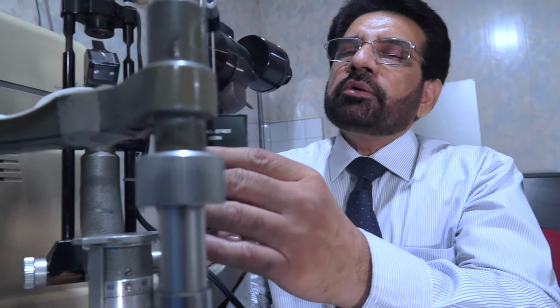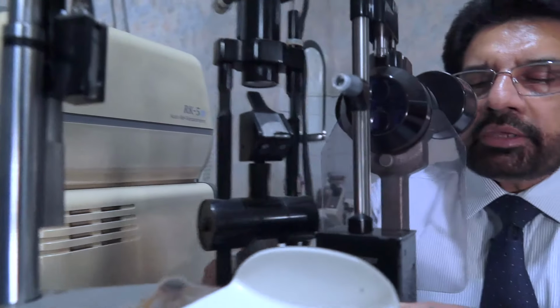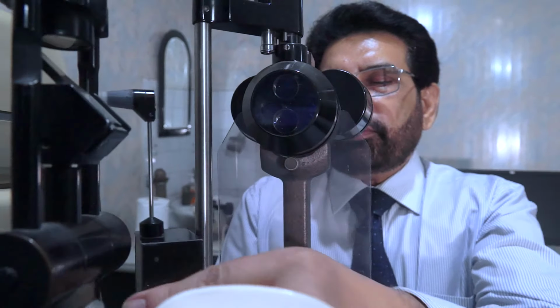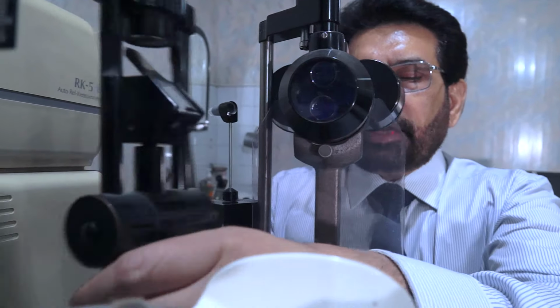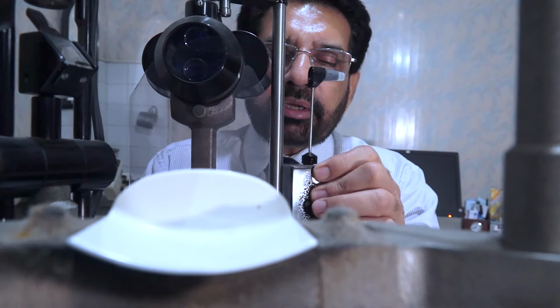It can be swung from one eye like this one to the other eye like this one here, and then we can bring it down on this side, and we can bring the illumination system on this. So if we want to examine the right eye, we use the illumination on the right side like this, and if we want to examine the left side, we should go like that, and so the illumination system should be on the left side of that. So that is how we can do it. We can perform a drop.